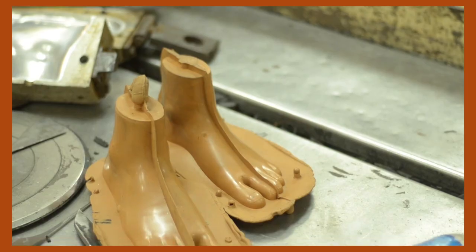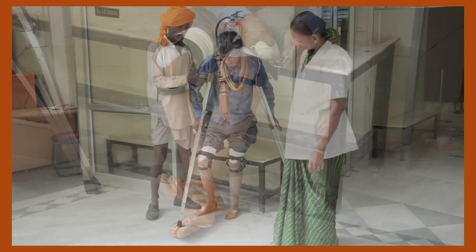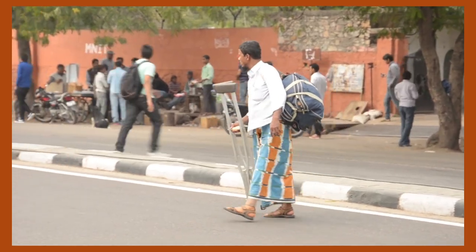Once the foot piece is ready, you have the whole pipe assembly ready. It is then fitted onto the human body and the person goes home with the leg. This whole process happens in a day because BMVSS has done all the planning — keeping all the parts ready, manpower ready — to handle large numbers of people and take the process forward.